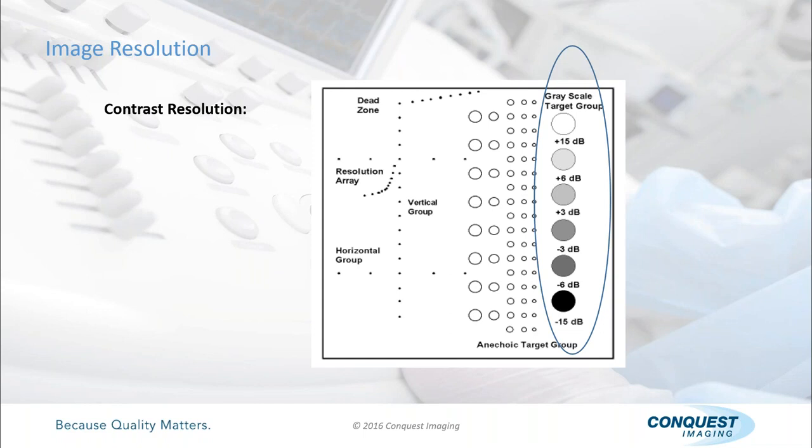So we know that we have different density objects here. 0 decibels represents the average. It means it's exactly the average. If it's more dense than average, then it gives a positive. If it's less dense, it's a negative. So up here would represent bone, and down here is approximating air. Basically, we don't get a good reflection from air, right? Or fluid for that matter.